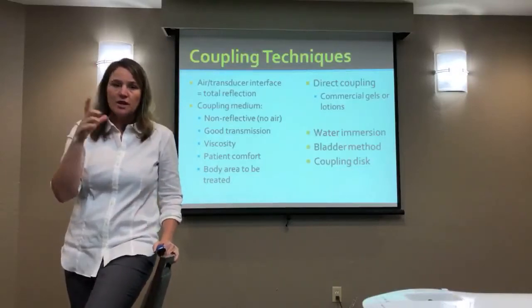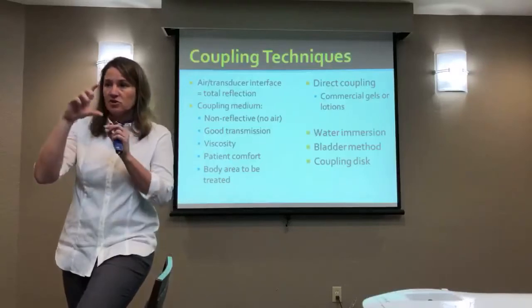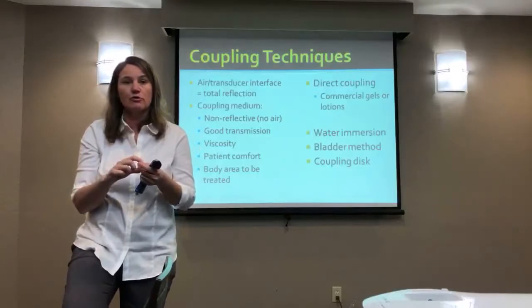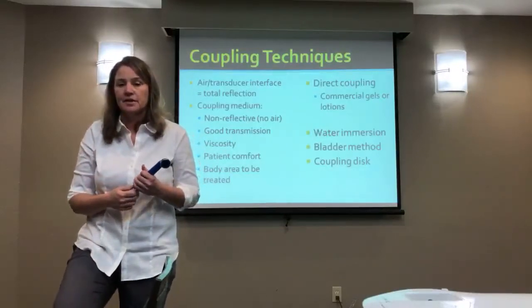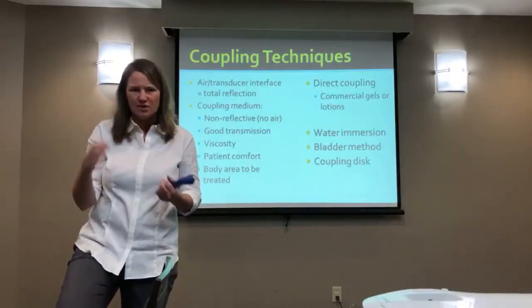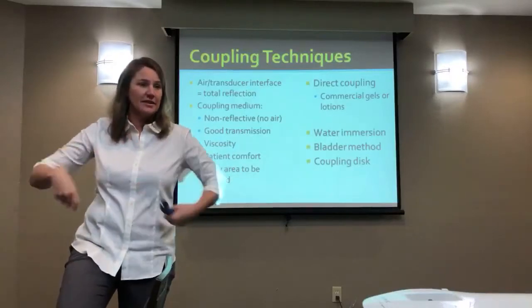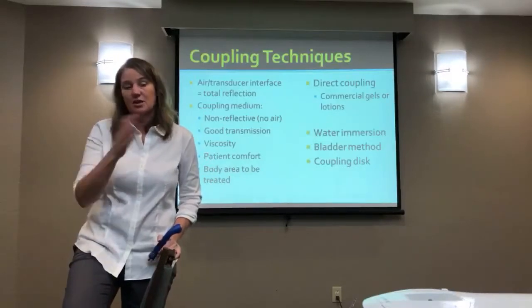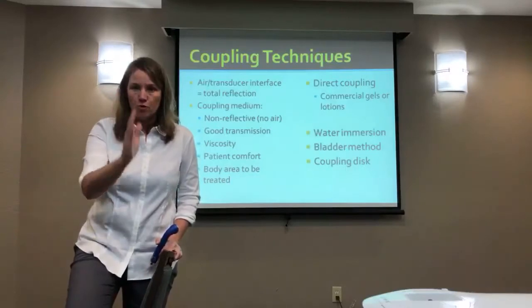And you can get individual, I have a couple of Doppler-size gel containers that are smaller, and you can get those. They're single-use dispensers now, so if you have certain people where you really need them to be sterile, they have individual sterile packets of gel. So there's things you can get. I think most of those are usually used in surgery, for diagnostics inside an open area, but they're available if you wanted to use it. So there's all different levels of keeping something for one person use.